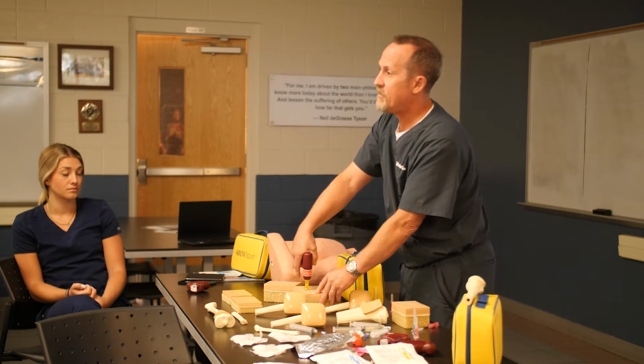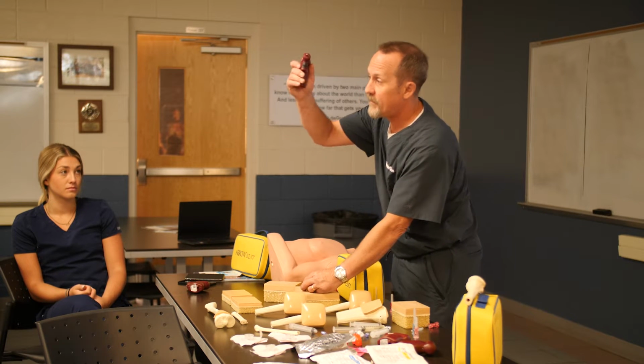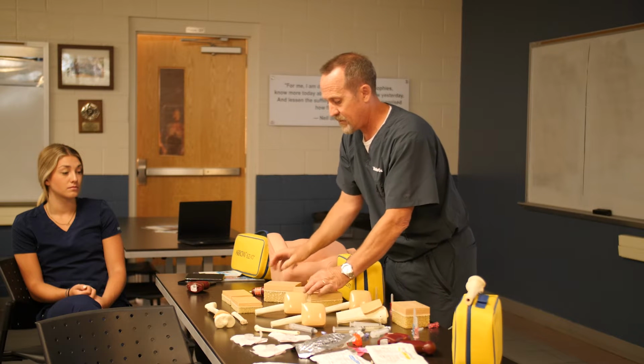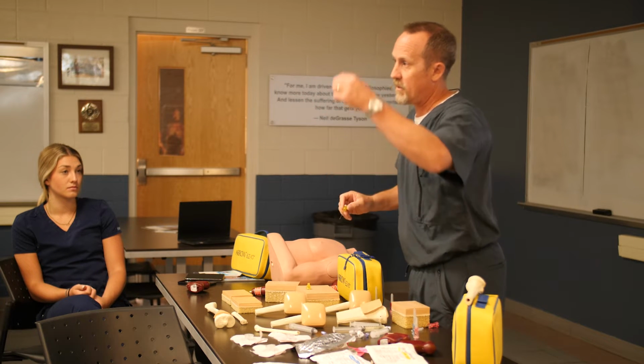See how it starts to sink when it gets through that cortex? I just let go of the trigger. Now I can hold onto the hub, lift the driver right off, and now we can actually take the stylet out, and we'll put it in our little sharps container.